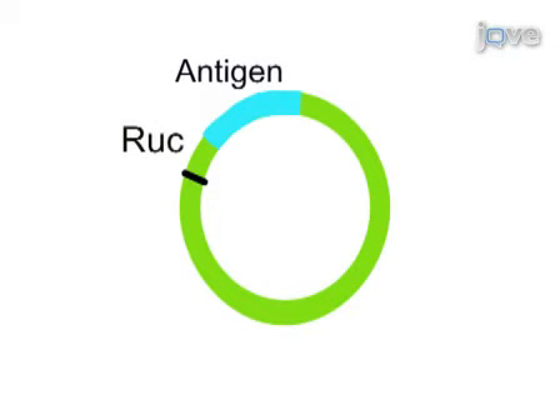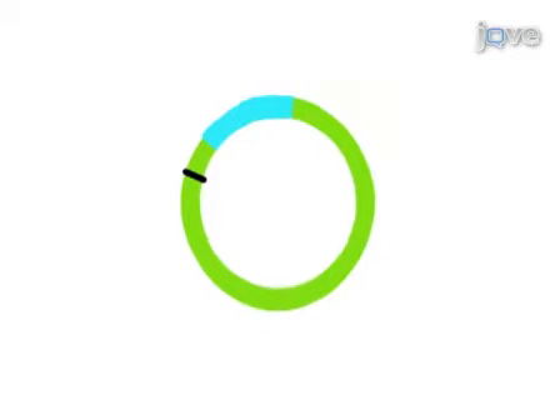This video demonstrates the steps involved in performing the LIPS assay. Antigens are expressed in COS1 cells as recombinant Renilla luciferase or Ruc antigen fusions. Crude extracts are obtained and used without purification.